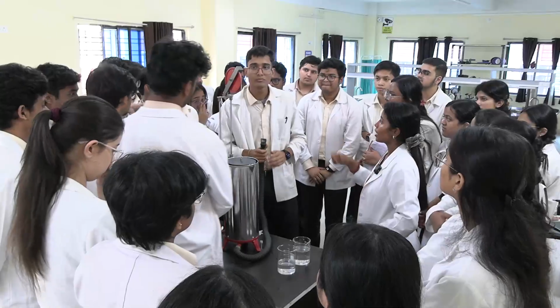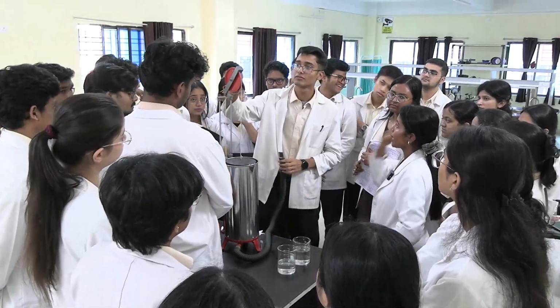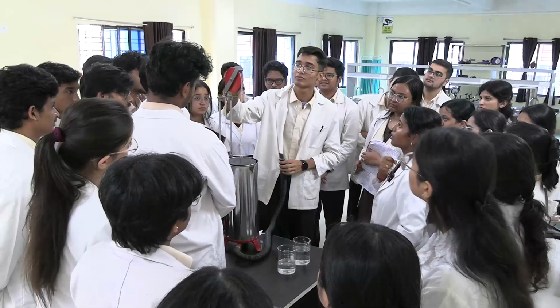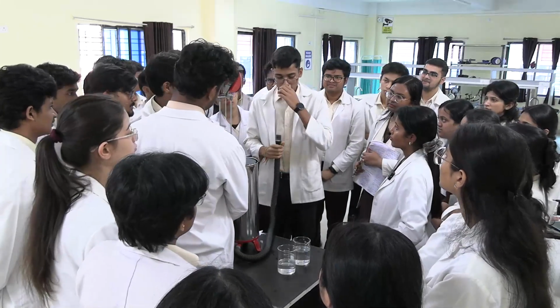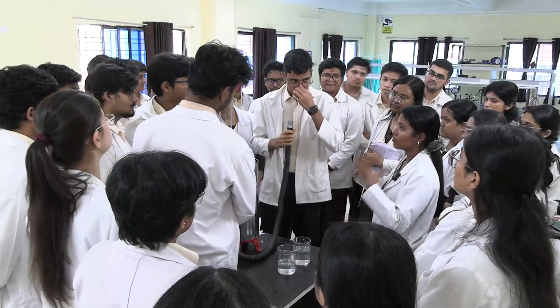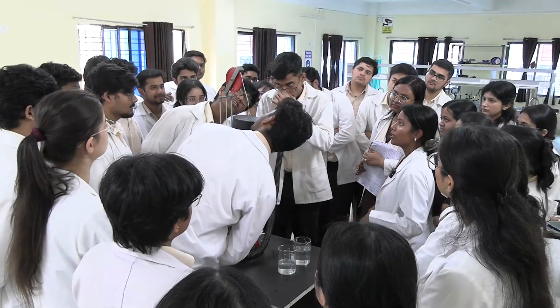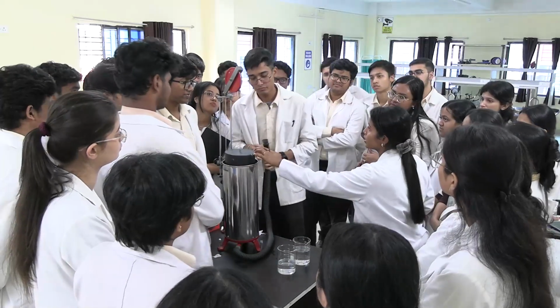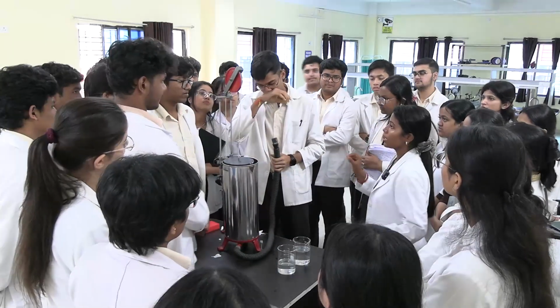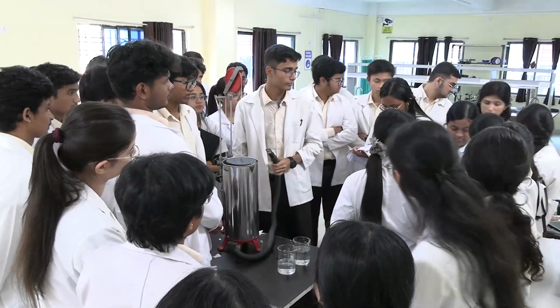Okay. So try once properly. You take maximum inspiration, then breathe out maximally, forcefully. Okay. As forcefully as you can. If you are not taking maximum inspiration, there is no air in your lungs, you will not be able to breathe out properly. How much? 4,000. Okay. So we are going to take 3 readings. We'll be writing in ml or liter. Okay. Then now give him one chair.